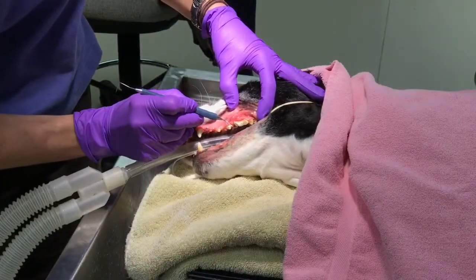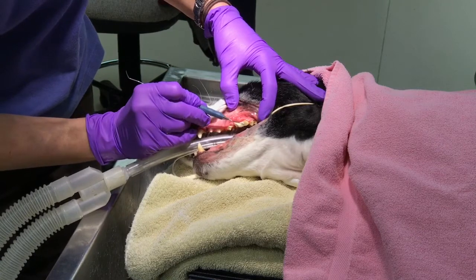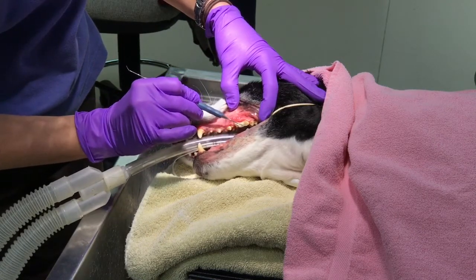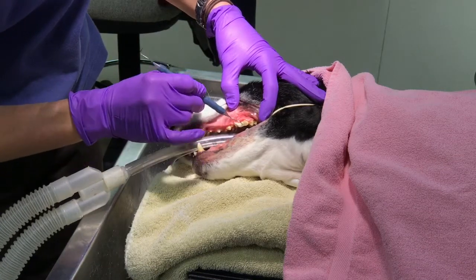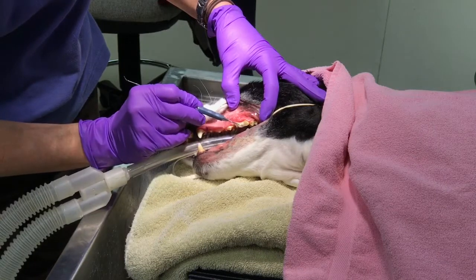We have a fracture to the upper fourth premolar right here, and we have exposure to the pulp canal. As you can see, this explorer goes deep into that, and that is where all the nerve and blood supply is. This is an older fracture, being that it's not currently bleeding when probed.